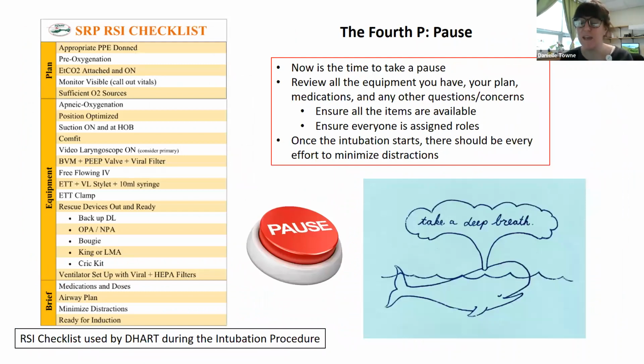Okay, our fourth P. Here's our pause. We want to review all of our equipment, review our plan, our meds, and talk about any questions or concerns. Because once the intubation starts, we want to minimize distractions.